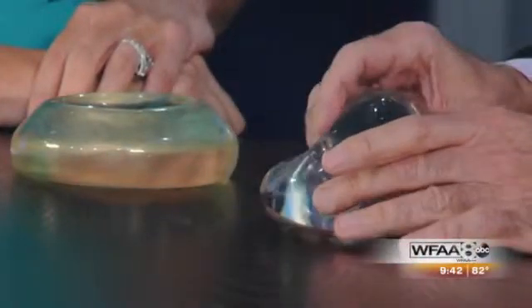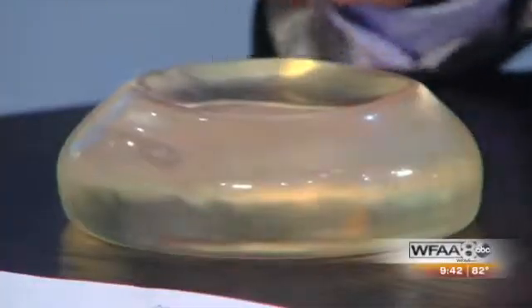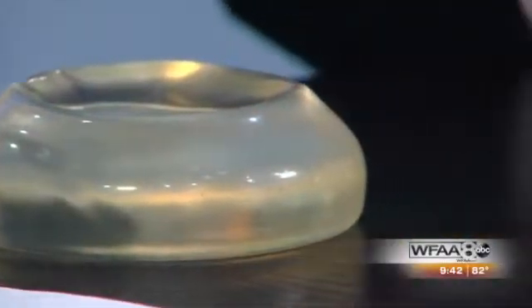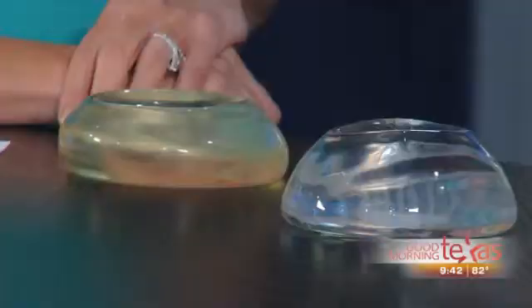All right, so you brought two different types of implants here today. Tell me about the differences between these two. This is the silicone gel. Notice that it's a form-stable implant, and if you touch the implant and squeeze it, it feels like a normal breast, as opposed to the saline implant, which feels more like a bag of water. Now, they both look pretty good on the body, but the advantage of the silicone is that when it is in the body, it's more form-stable. It maintains that nice round shape, round form, and it lays more natural when it goes in the breast. So it looks more natural, and when you feel it, of course, it feels more natural. So you have a better feel, a more natural feel, and a more natural look.